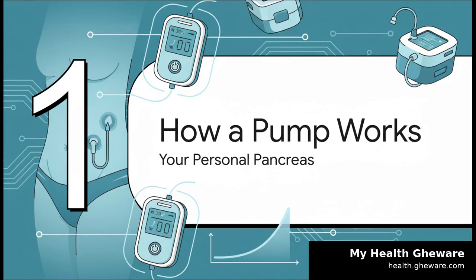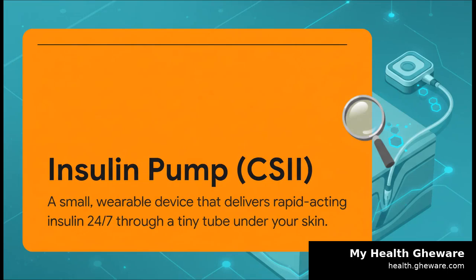Okay, so let's dive in and really get into the nitty-gritty of how this little device actually works. Think of it as your own personal, external pancreas. So at its core, an insulin pump, you might hear it called a CSII system, completely replaces all those daily injections. So instead of juggling long-acting and rapid-acting insulins, the pump uses only rapid-acting insulin, and it delivers it continuously through a tiny, super flexible tube that just sits right under your skin.